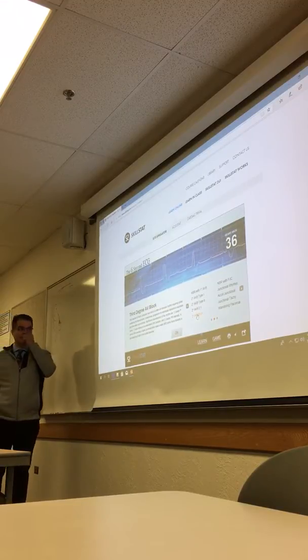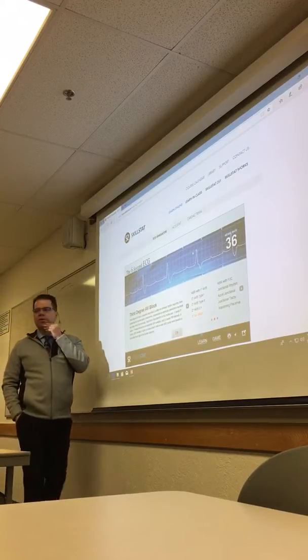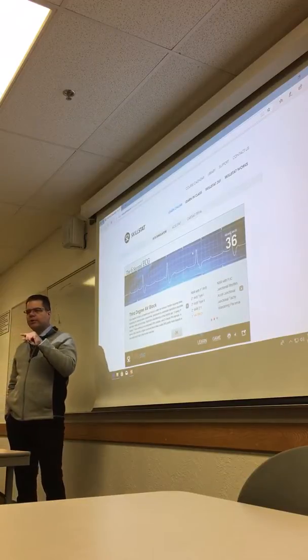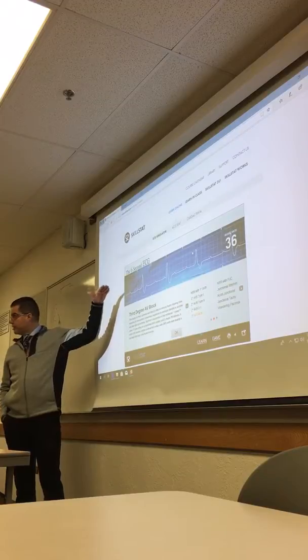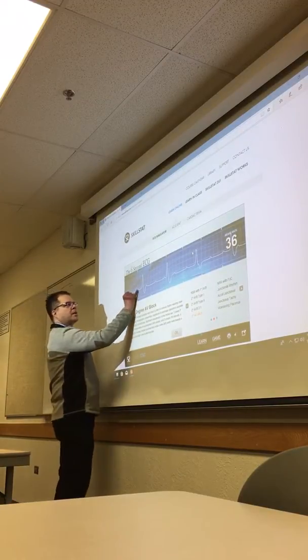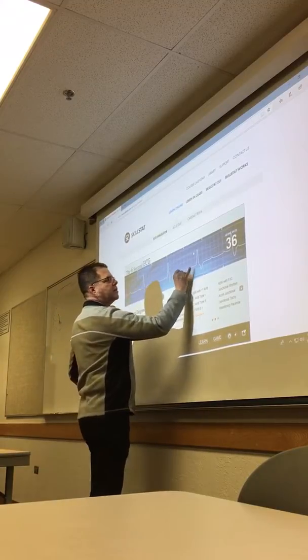So this is a third degree block. And this one will get you if you don't pay attention to look at your P waves and are they regular, look at your QRSs and are they regular. That's part of that algorithm on that step that we gave you the very first slide, right? So if you look at this, my P waves march out exactly as they should.